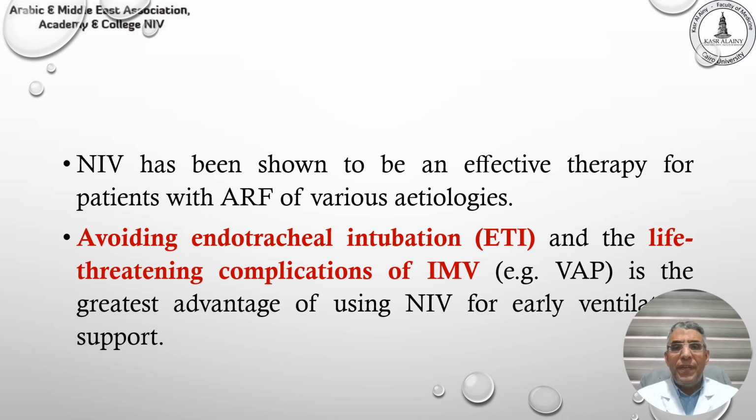Non-invasive ventilation has been shown to be effective therapy for patients with acute respiratory failure of various etiologies: COPD, cardiogenic pulmonary edema, immunocompromised patients, and during weaning from mechanical ventilation. The main advantage of non-invasive mechanical ventilation is that it avoids endotracheal intubation with its associated complications, such as ventilator-associated pneumonia, patient-ventilator asynchrony and fighting the machine, and also ventilator-induced lung injury. This is the greatest advantage of using non-invasive ventilation for early ventilatory support.